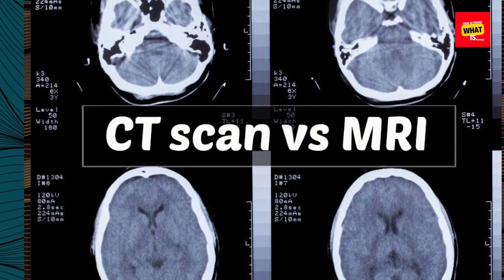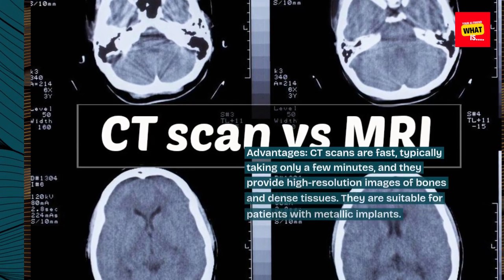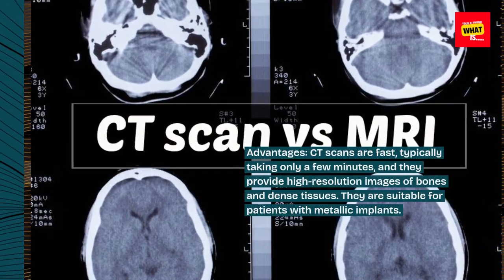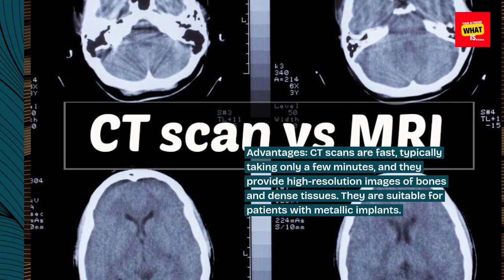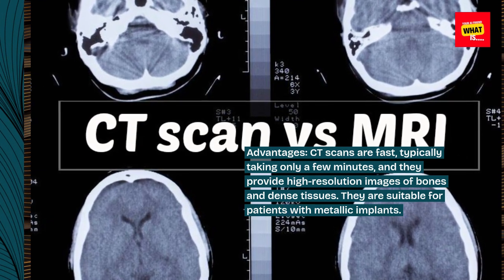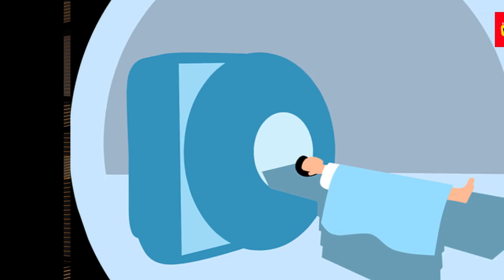Advantages: CT scans are fast, typically taking only a few minutes, and they provide high-resolution images of bones and dense tissues. They are also suitable for patients with metallic implants.